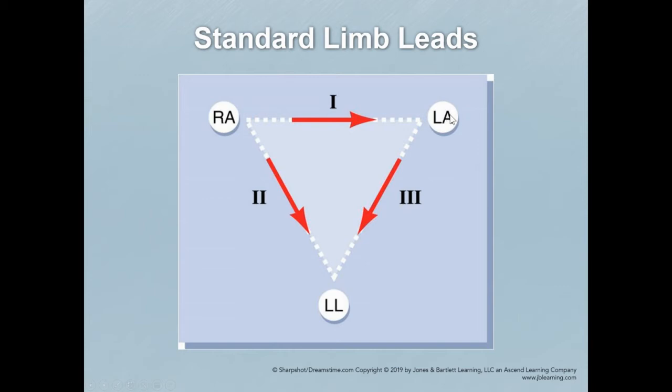Remember that just because we put an electrode on, that electrode is not always positive or negative. It is positive or negative dependent on what it's trying to look at that time. Current flows both ways. Then if we're going to our lead 2, which is the one we monitor in the most, because we get a diagonal view of the heart, goes from our right arm down to our left leg. And our right arm, once again, would be negative and our left leg would be positive.